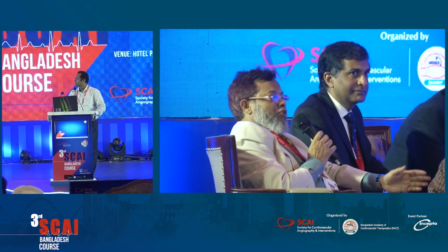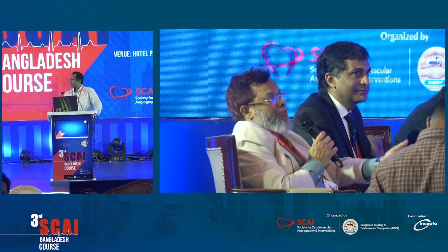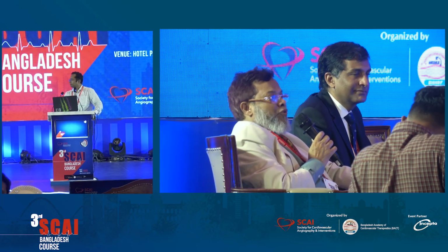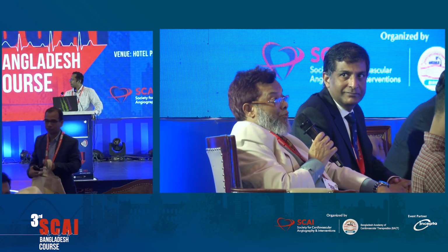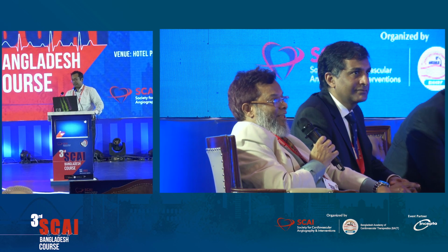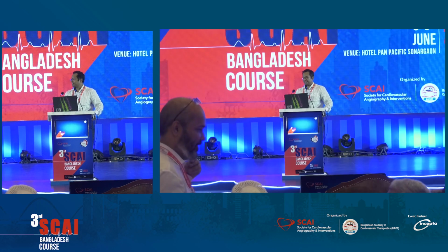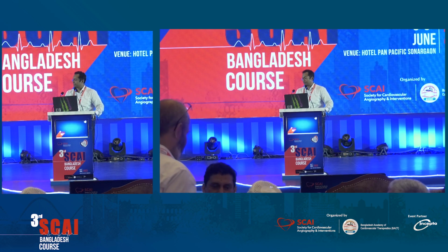Even if the radial artery is lost, no problem. In 95% of cases, it persists. In 3 to 4% of cases with radial approach, you will lose the radial artery, no problem. But you should check the situation of the radial artery after a lengthy procedure. Exactly, sir. As we did very little manipulation in the right radial artery, we did not take any shot. But we should take it. It should be done. Thank you, sir. Thank you once again.